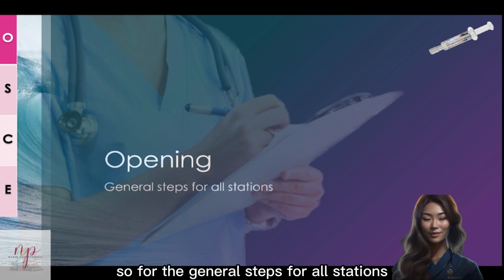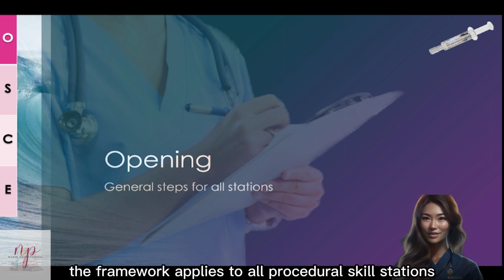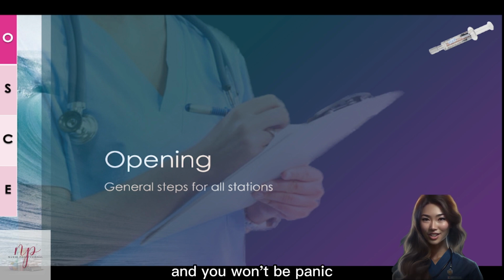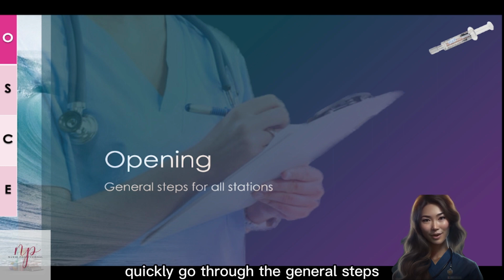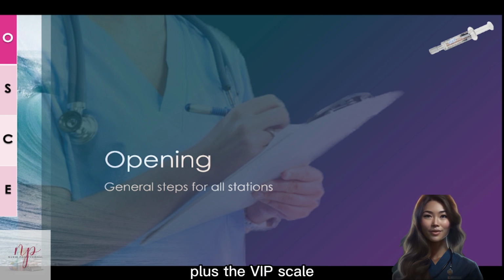For the general steps for all stations, please refer to the video on the OSCE framework. You use the framework and apply it to all procedural skill stations. Then it can help you memorize all the steps more easily and you won't panic. But for this video, I will just quickly go through the general steps, because the main purpose of this video is the IV flush plus VIP scale.